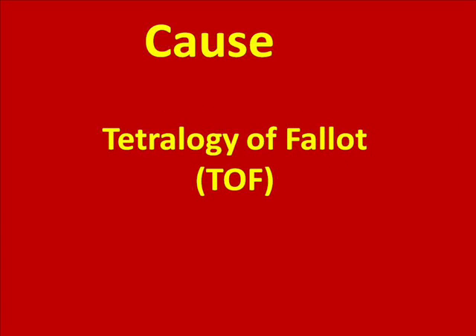The boot-shaped heart sign is a typical finding on the chest radiograph of a patient with Tetralogy of Fallot, or TOF. It is a condition found in children.